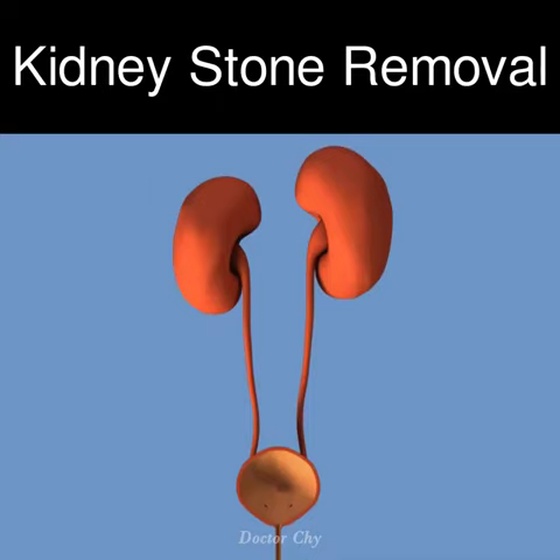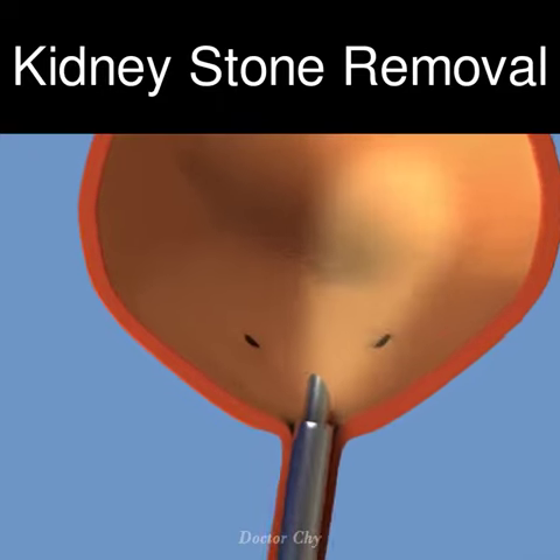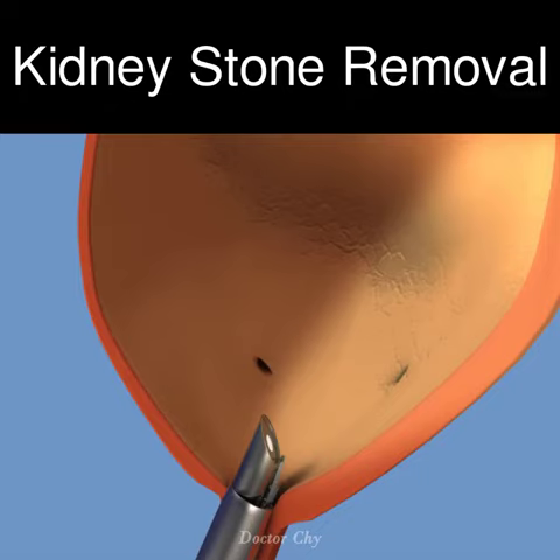Ureteroscopy is typically performed with the patient under general anaesthesia. A small tube is passed through the urethra into the bladder and from there up into the ureter and into the kidney.